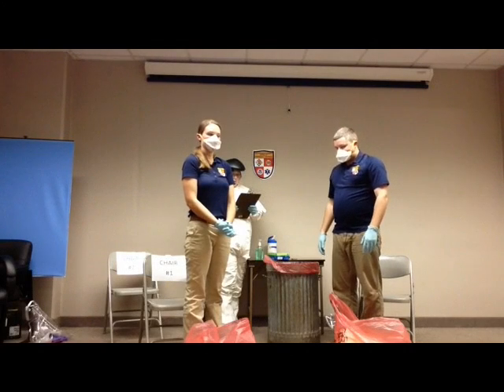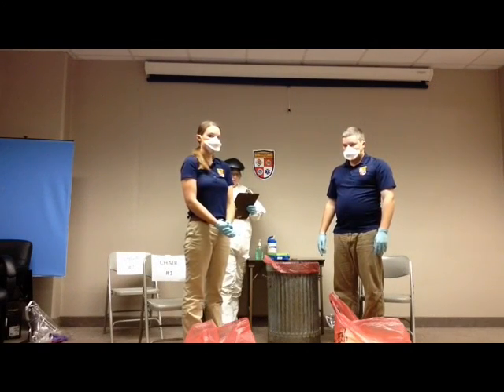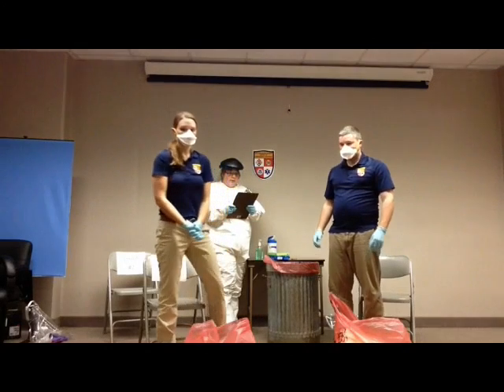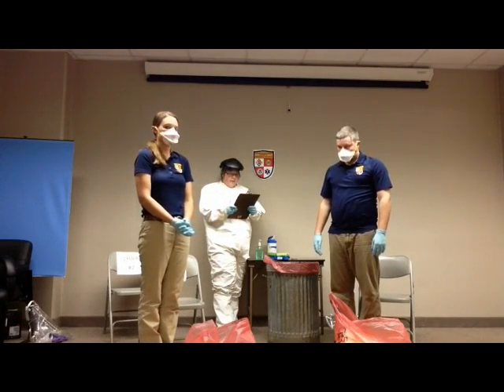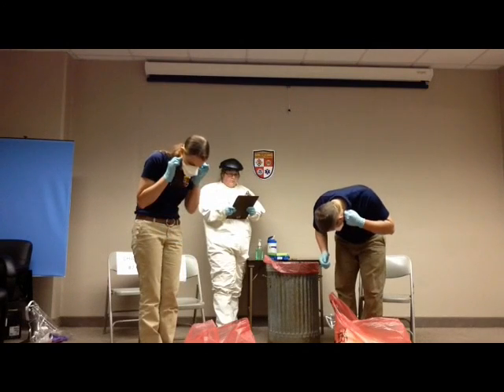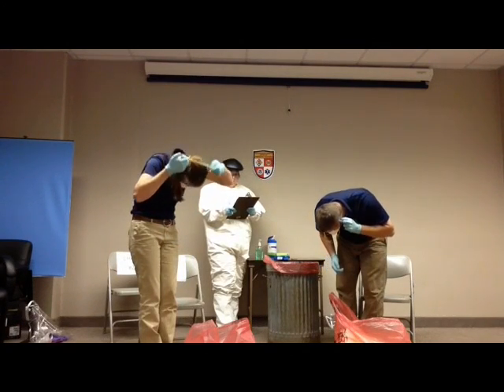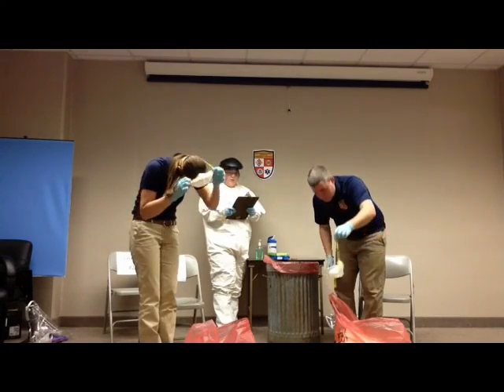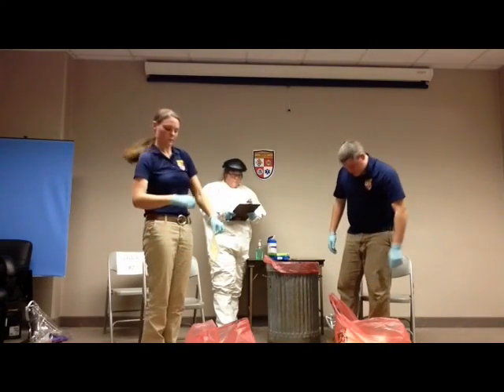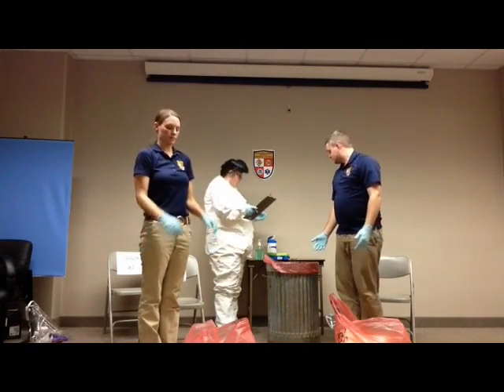Remove N95 respirator by tilting head slightly forward, grasping the bottom strap and pulling it overhead, followed by the top strap. Do not touch front of N95. Hold N95 using top strap and discard mask. Inspect and disinfect gloves.